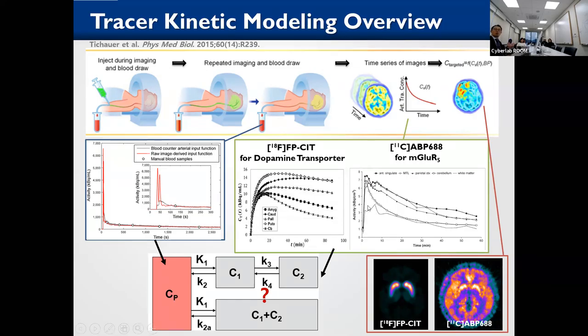But small regions may still show some noise in the TAC curve. Anyway, we get the plasma input TACs and tissue TACs, and compare them using CP and CT. Using CP, we generate a pseudo TAC, and we compare it with the measured one. By adjusting the parameters, we can finally find the most similar generated TAC. It means there are K parameters that make the most similar TACs, and those parameters are our final result.